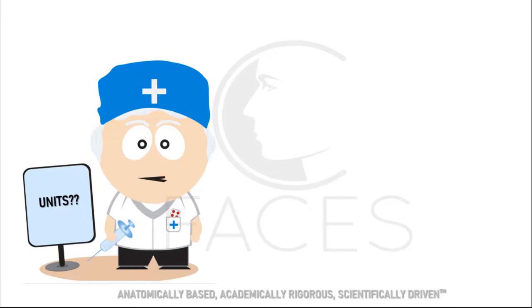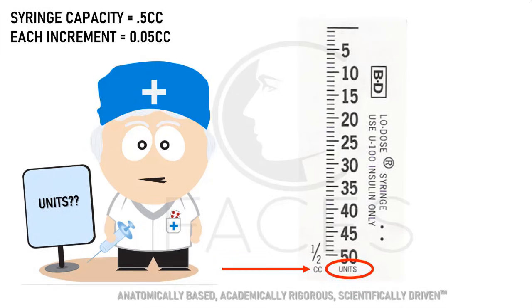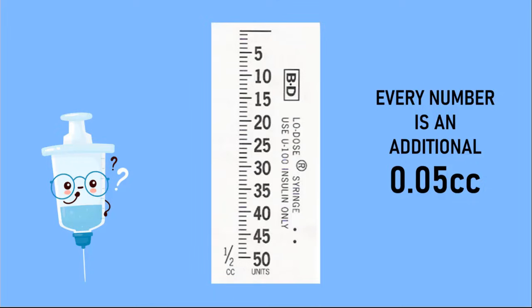So what if you have a syringe that says units on it? Well, don't panic. It also tells you the volume capacity as well. In this case, the syringe holds a half cc. Therefore, each numbered increment is valued at 0.05 cc's. As you can see here, every numbered line increases the liquid volume by 0.05 cc's.